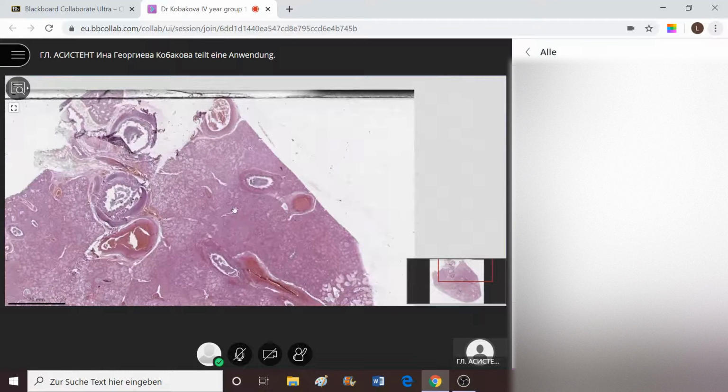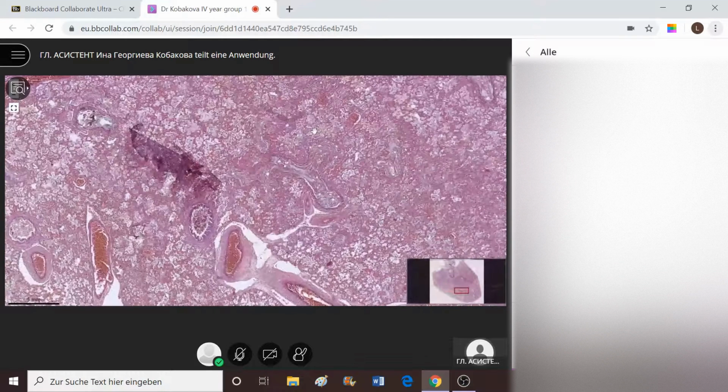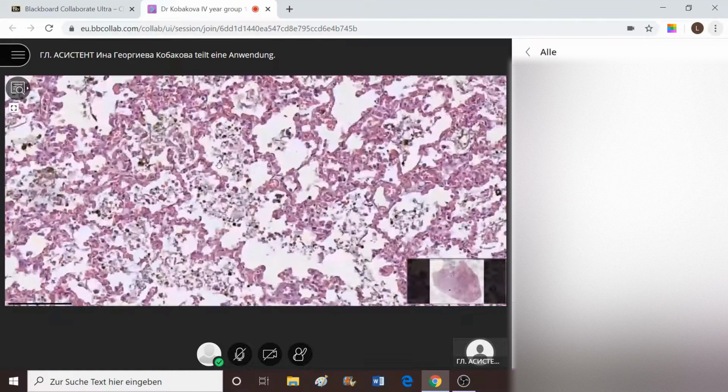placenta and death. What we should see inside in the lungs would be filled alveolar spaces which are partially opened, but they're filled with some sort of fluidish stuff which is rich in these flattened strands which are squamous, and they are floating in the amniotic fluid.